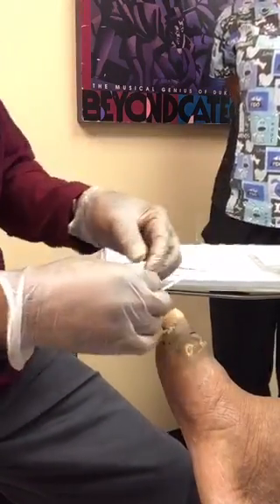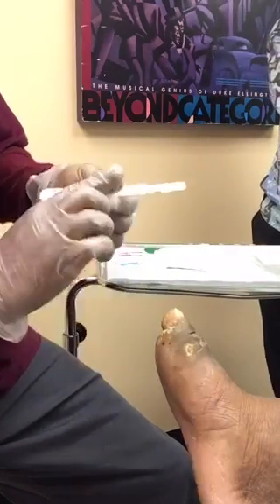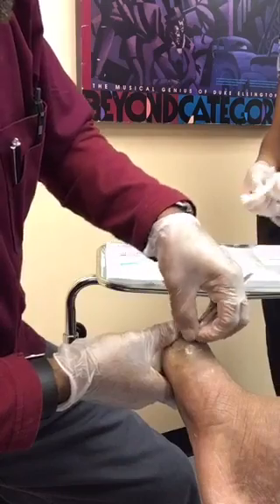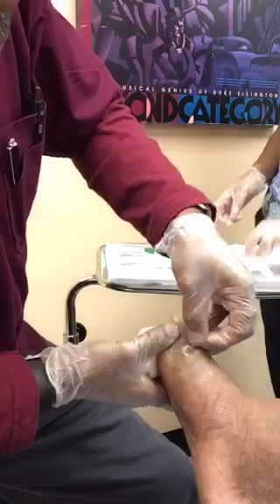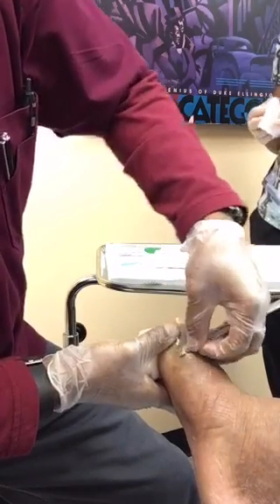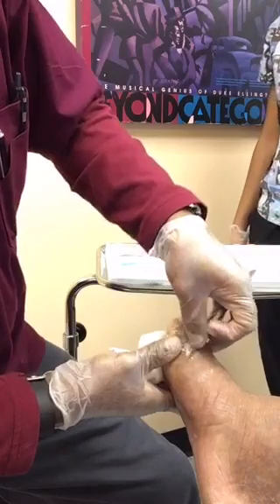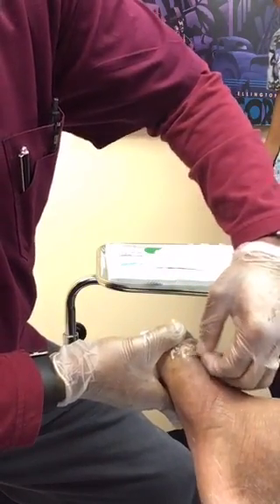Sharp debridement is fine for this. This wound was making progress, and it's not uncommon for them to stall a little bit at this point. So we're applying this amniotic graft to help jumpstart the healing process. The amniotic graft comes from donated human placenta that goes through a very rigorous cleaning, sterilizing, and separating process to get the right tissues for the particular type of wound.